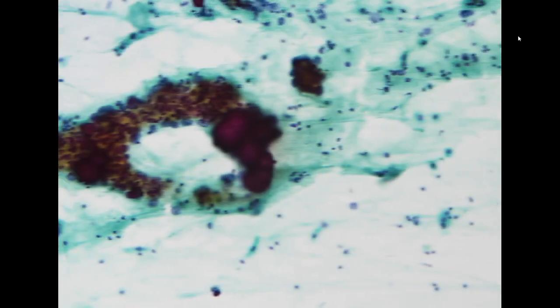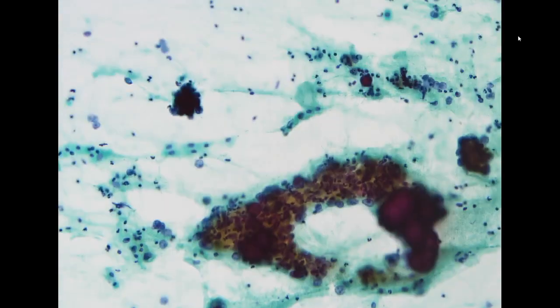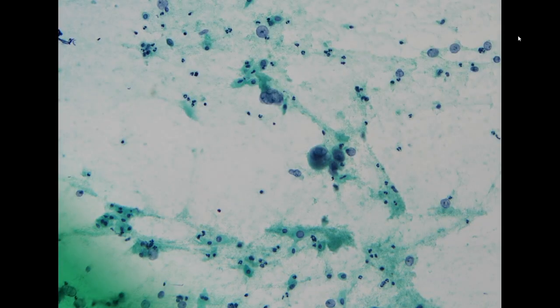And when we check the history, the patient had a past history of cervical adenocarcinoma, HPV negative, which was a clear cell carcinoma. Occasionally, clear cell carcinoma can have very prominent psammomatous calcification. So this is compatible with a recurrence of disease. These very high-grade tumor cells are unusual for HPV, and the history confirmed that this is non-HPV associated cervical adenocarcinoma.